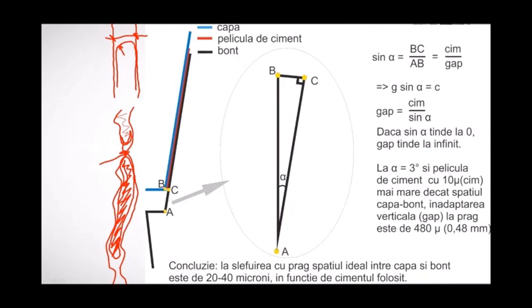And it is also protected. I mean, it's inside. You know, if this free space goes out, then microbes can go in and out. If not, they try to find food in a vital abutment if you left it vital. If not, they simply eat dentin because dentin is good anyhow. Microbes like it. And then instead of the abutment, you will find, who knows, a carrot.